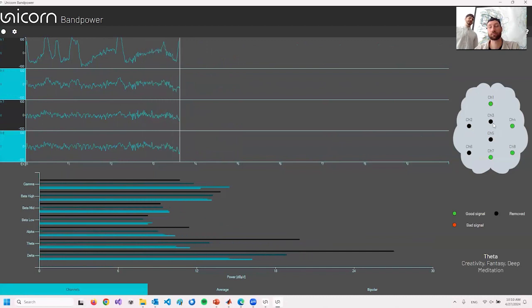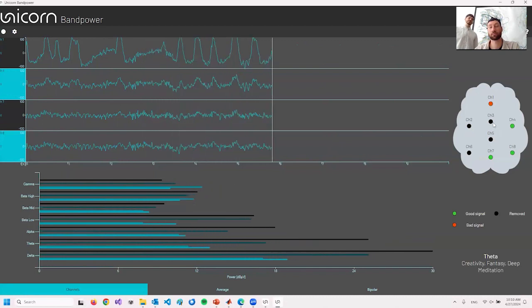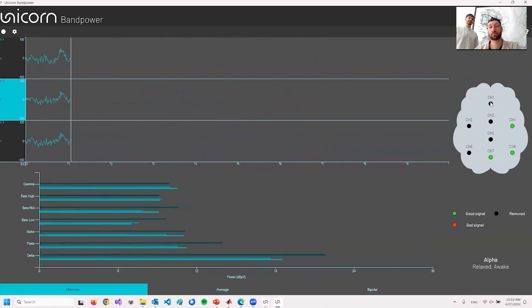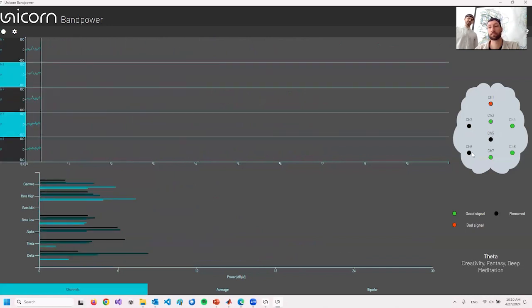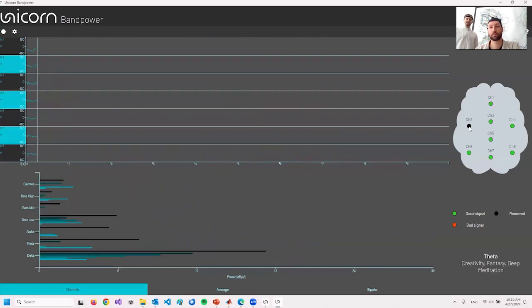Like right now, Leo is blinking. You can see the eye blinks on the first channel. And if he clicks the first channel again, then this channel is gone and the other channels are not affected that much. So you might want to use that feature as well.